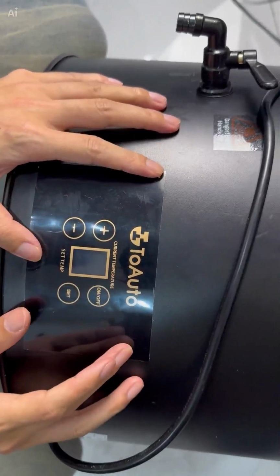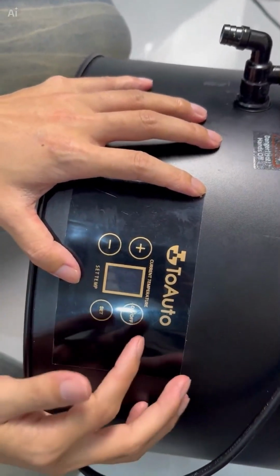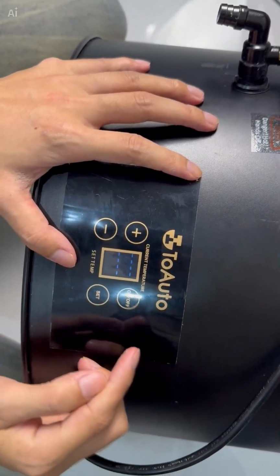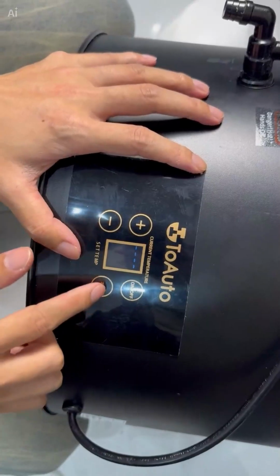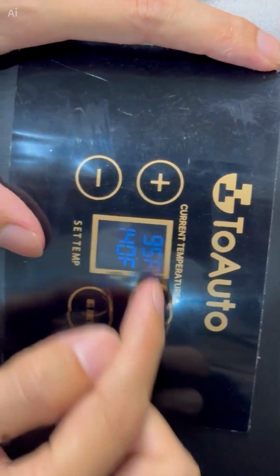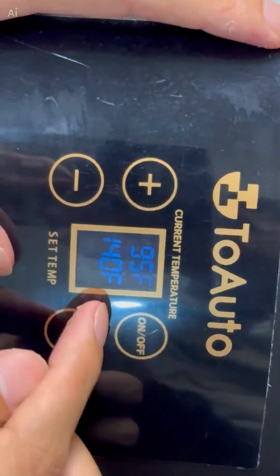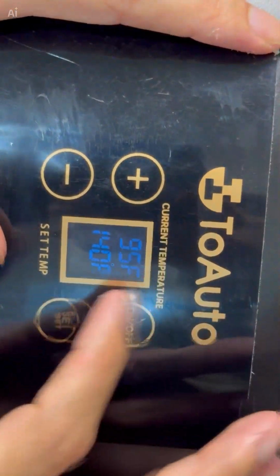Okay, after we finish sticking it, we need to power it on to test if it's placed correctly. Then click this switch, then click either the plus or minus sign, and then press its exit button. Okay, then you can see that both rows of numbers are very neat and also very level. This way, it's applied correctly.